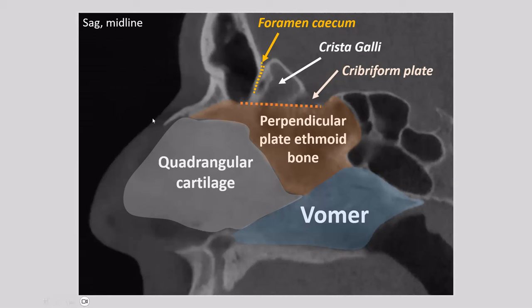Let's start with the sphenoethmoidal recess. We can see it over here with arrows drawn. It is basically a small connection connecting the sphenoid sinuses to the olfactory recess of the nasal cavity, and they drain into the superior meatus as shown on the sagittal image. We can also see the sphenoethmoidal recess on the sagittal image. The sphenoethmoidal recess drains the sphenoid sinuses and the posterior ethmoid cells. What's the difference between the posterior and anterior ethmoid cells? That's what the next slide is about.